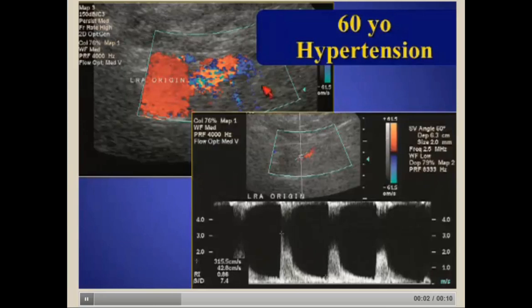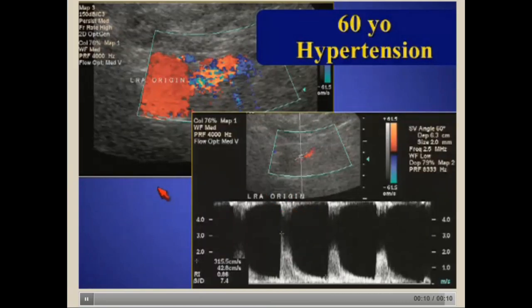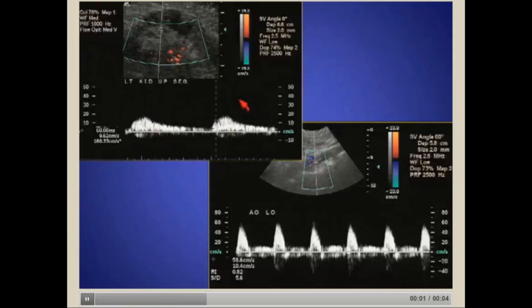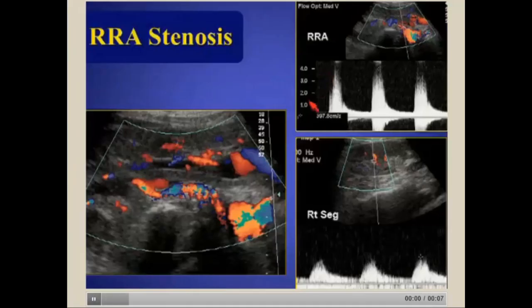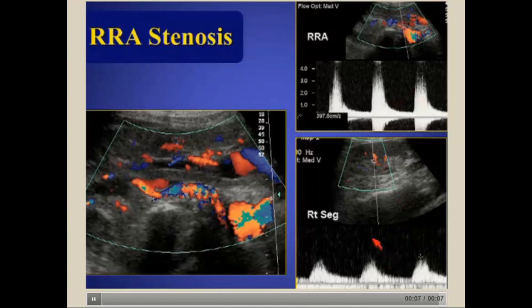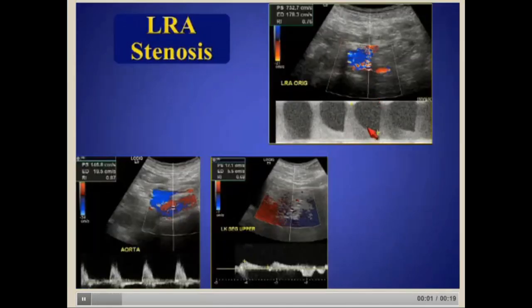A few more examples. Here's a 60-year-old with hypertension showing aliasing at the site of stenosis, elevated velocities on spectral waveform, and a very slow rise to peak systole in the hilum. Here's an example of bilateral stenosis: on the right, appreciate the aliasing in the vessel, high velocities, and tardus-parvus waveform; on the left, high velocities in the stenosis and a tardus-parvus waveform. Comparing both sides clearly shows the right side has a good upstroke with early systolic compliance peak, while the left side does not — a rounded tardus waveform.